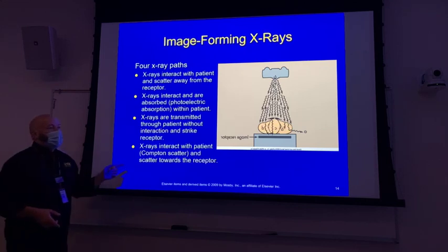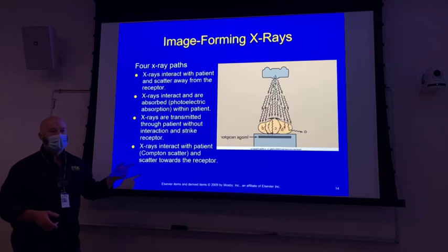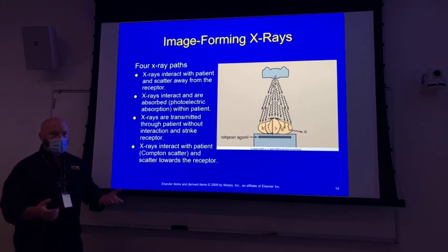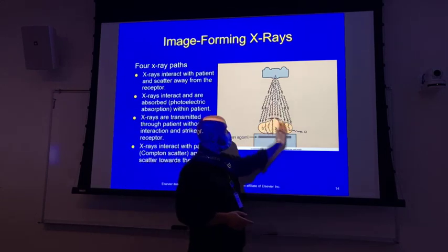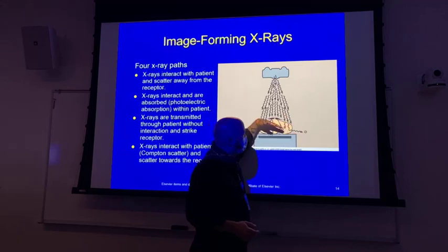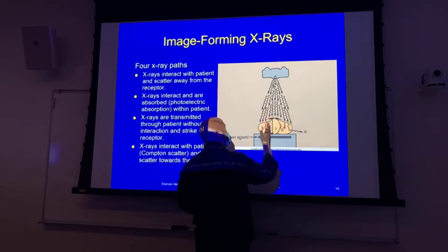So the only thing that we have left, let's see, well, we've kind of covered the photoelectric interaction, but we've got the Thompson, the Compton, which is what we're just now describing. And the thing about the Compton is, and this diagram is a little simplistic in that it's just showing that photon scattered off, okay? So Thompson parallels the transmission, right?